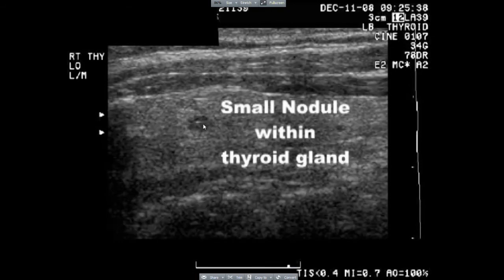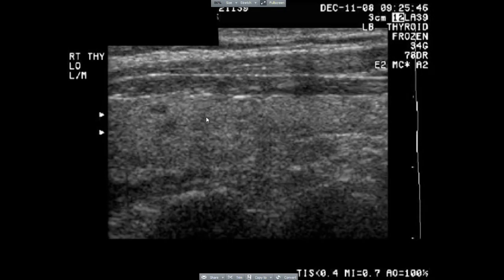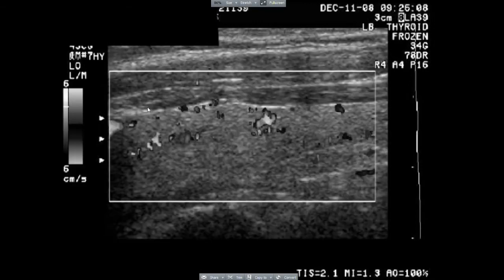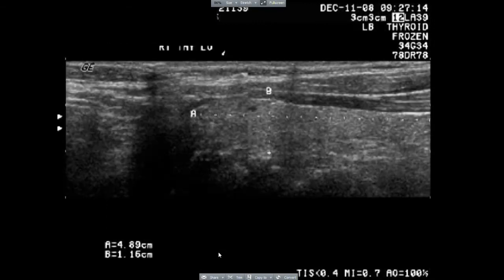A small nodule is seen within the gland. A small nodule is seen in the right lobe of the thyroid gland measuring 0.26 centimeters. This is very small.